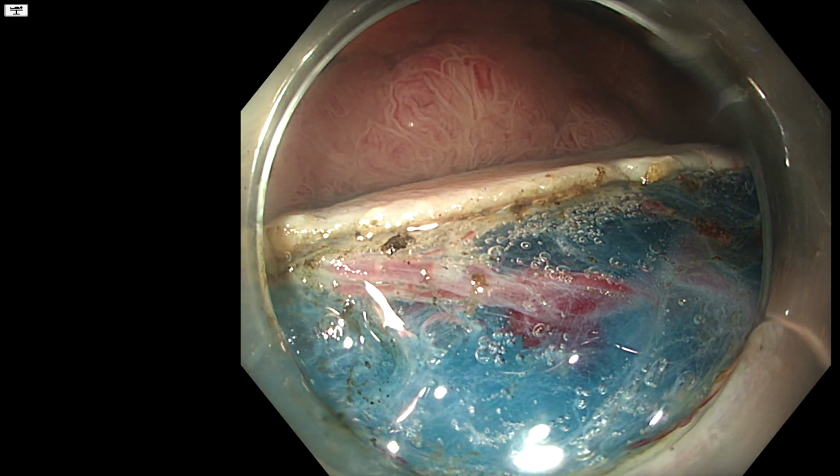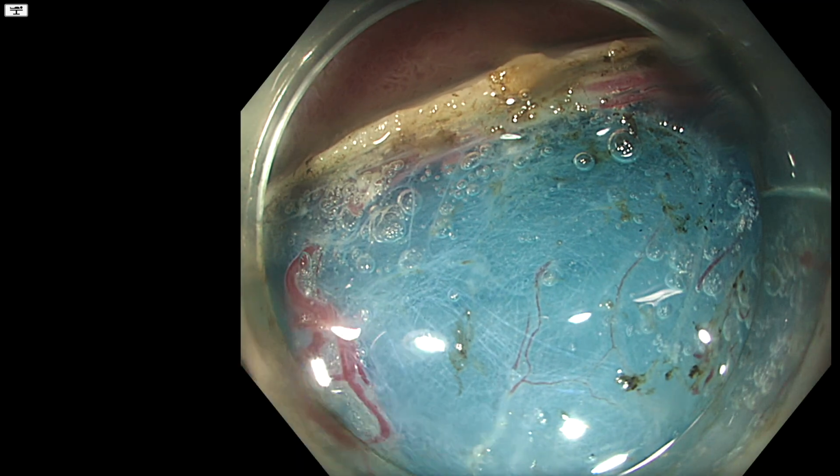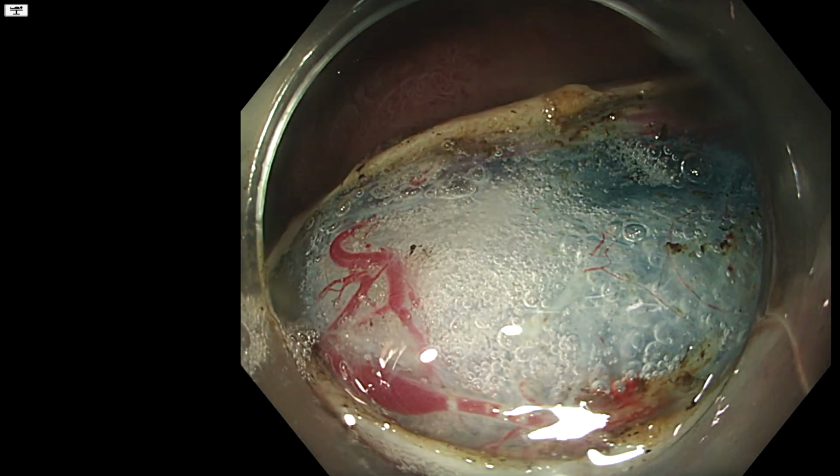Okay, so that looks much better actually. We've got a nice blue submucosa, which is what we're looking for, with no hematoma, no active oozing, and no charring.